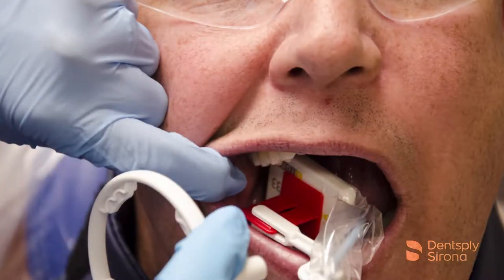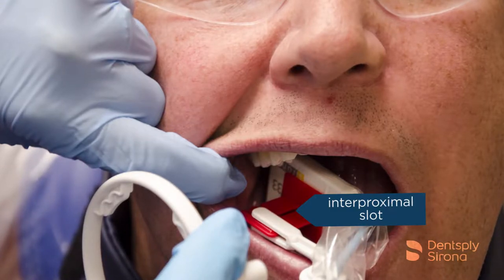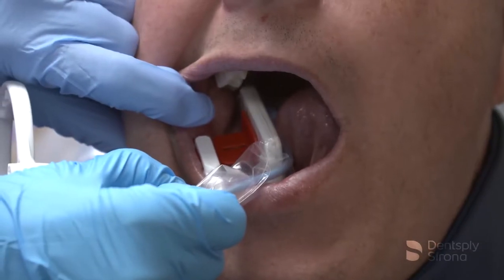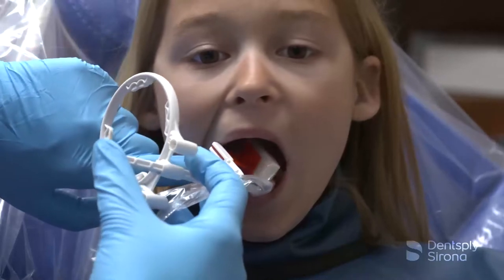Features and benefits include an interproximal positioning slot which aids the clinician in visualizing the central ray being parallel to the interproximal spaces, which will help open the contacts. The base is large and the bite tab is wide, which helps with occlusal engagement and stability.